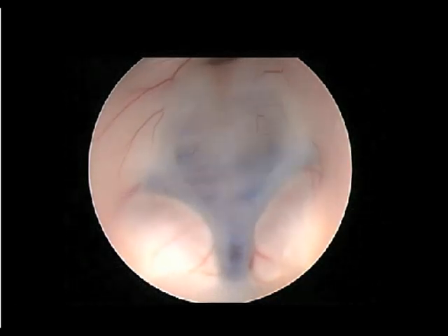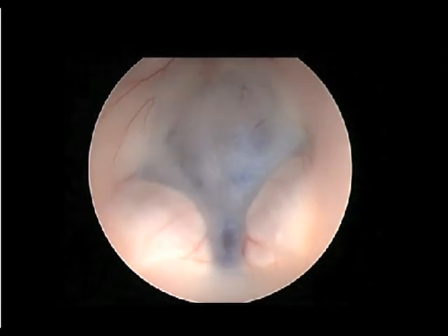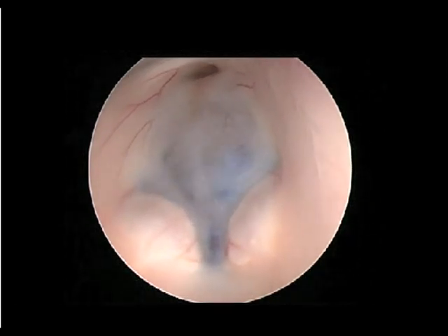The paired mammillary bodies are seen posteriorly, and the shadow in between them is the basilar artery. The location of the basilar artery can be variable, so it is important to study its relationship to the floor of the third ventricle on preoperative imaging.